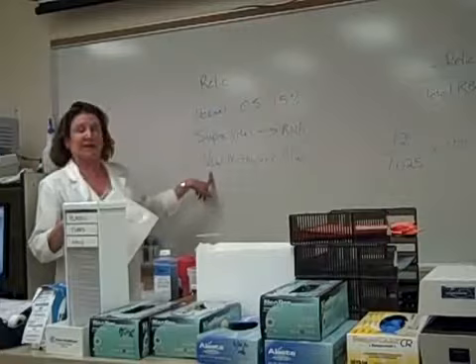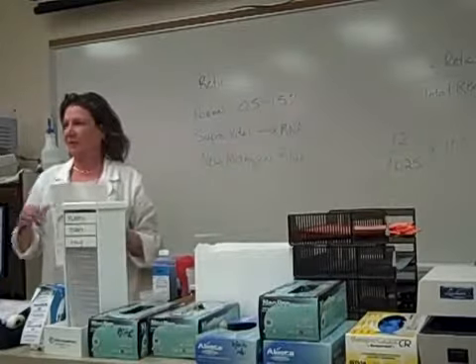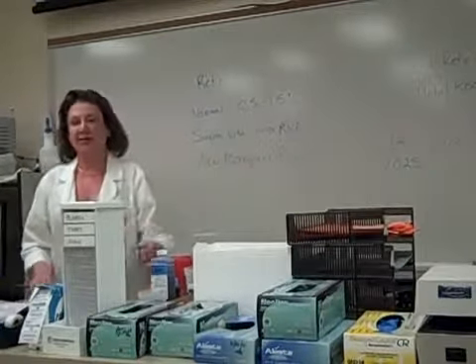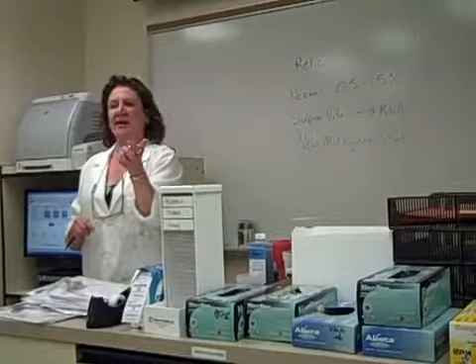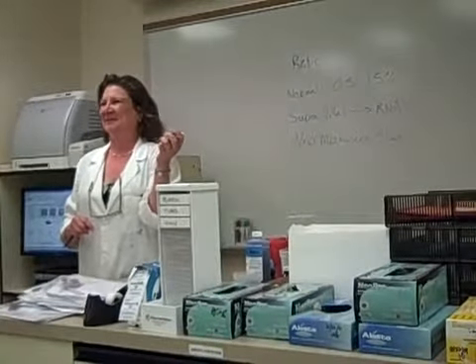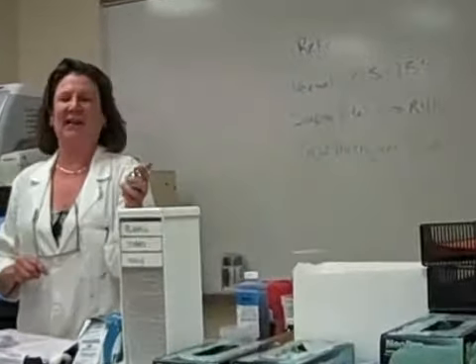The supravital stain we're using in class is new methylene blue. There's a couple of other different versions, but we use new methylene blue. So the idea is you're all going to get a tally counter like this. They're up in the cabinet up there. And with your left hand, you're going to count, guess how many red cells? At least 1,000. Okay? At least 1,000. I can't count that. Yes, you can count that.